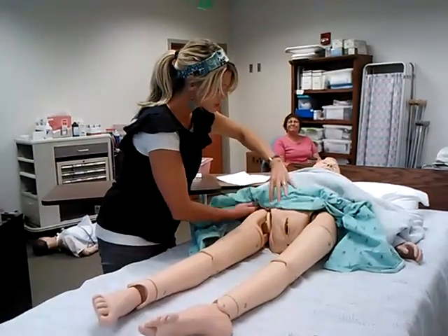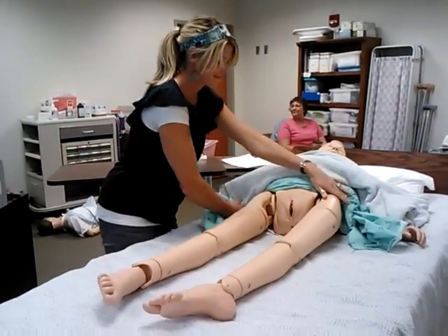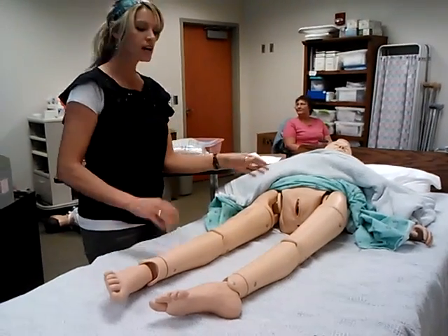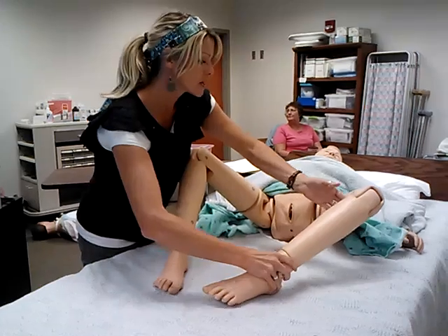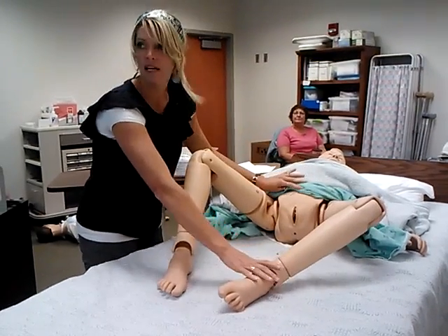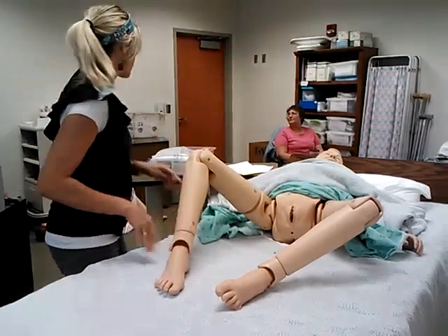Okay. Then you need to expose her area and help her into a comfortable position. And there's nothing comfortable about this position. It's awful and it's embarrassing, so be as quick as you can.